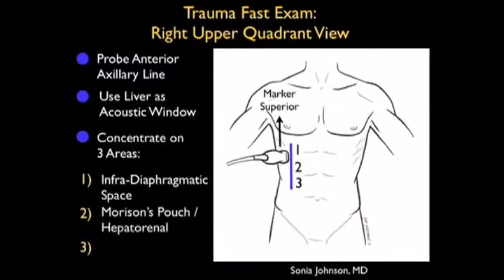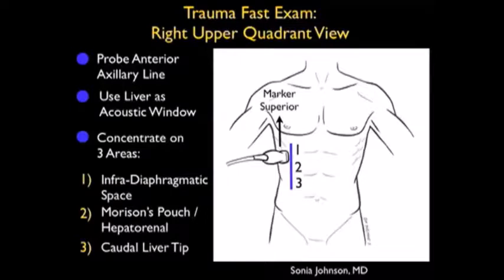looking at that region just below the diaphragm and above the liver, and actually looking into the chest cavity for a hemothorax. Position two is the traditional Morrison's pouch or hepatorenal interface, and position three rounds out the exam by looking at the caudal liver tip, representing the beginning of the right pericolic gutter.